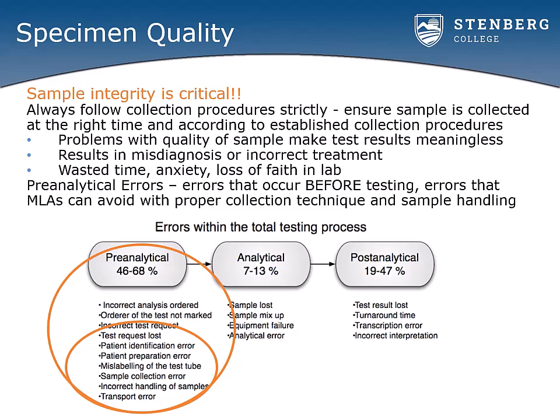We've discussed collection techniques such as correct labeling of samples, especially tubes for the blood bank department, but all labeling is important. We've discussed avoiding microclots in hematology samples by mixing the EDTA tube immediately. And we discussed filling the sodium citrate tube completely to a 9:1 ratio for coagulation samples to avoid dilutional errors. All of these errors can affect test results and can be avoided by the MLA using proper technique and sample handling.